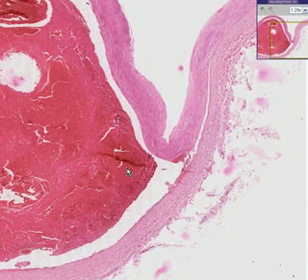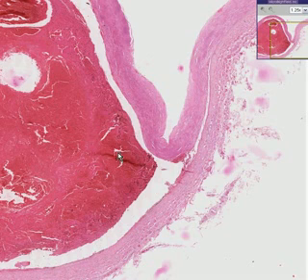Here's an arterial wall. You can see it's degenerated. You can see that it's not only degenerated but weakened such that this blood here has been allowed to dissect in its layer. So this could probably be the real lumen of the aorta, and here is a part of the wall that has been weakened and where the blood has dissected through.